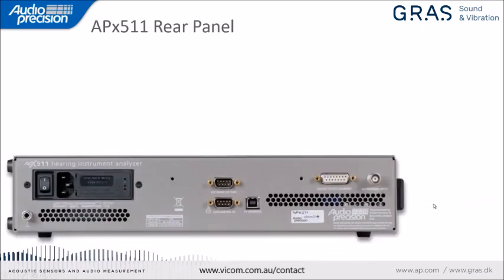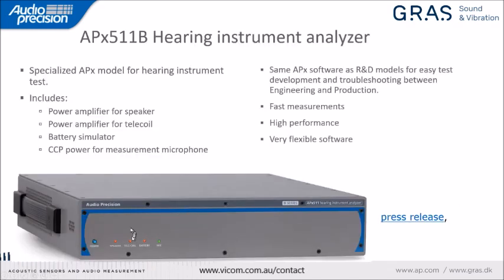Just a quick look at the rear panel of the 511. So I wanted to point out, this is one of the only audio analyzers, I think it is the only audio analyzer we sell, that does not have input-output connectors on the front panel. All of the connectors are on the back panel. The only thing on the front panel is LEDs to indicate the speaker is being used or the telecoil, that the battery power is on, and then the microphone CCP power is on.